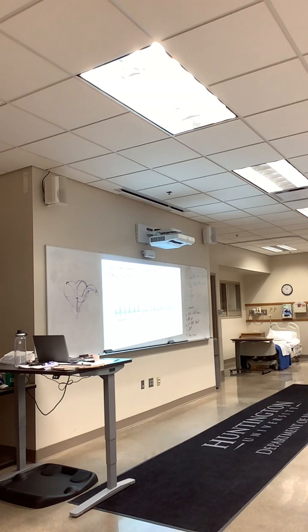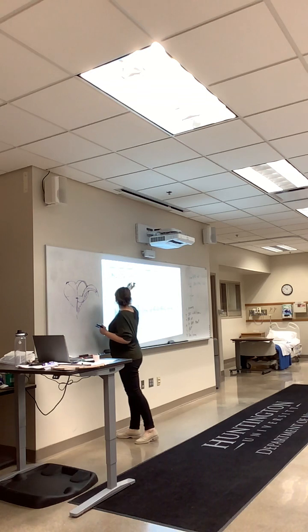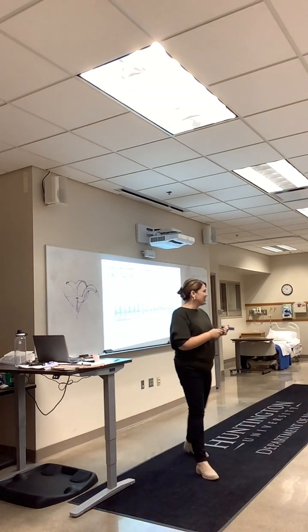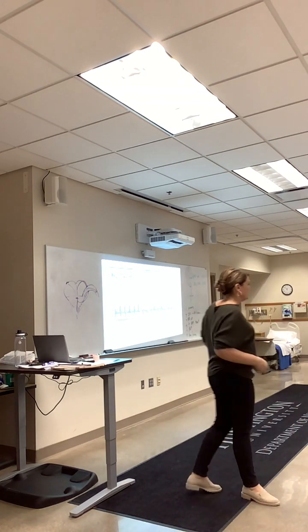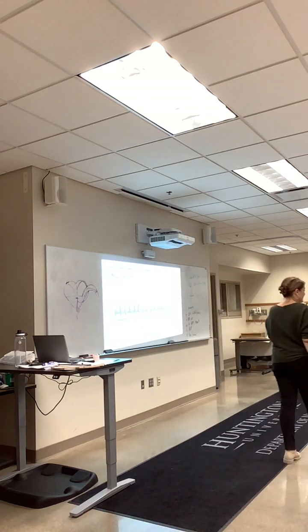Sinus tachy, I will tell you there is an actual rate range for it. When it gets higher than that, they call it something different. Sinus tach is from 100 to 150. You can go 101. I mean, it's just relative, right? On a test, I'm not going to ask you exactly what 100 is.